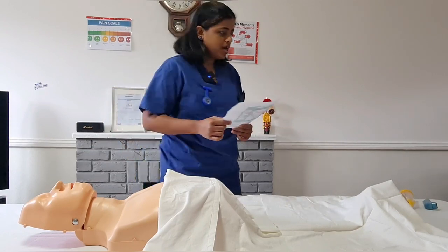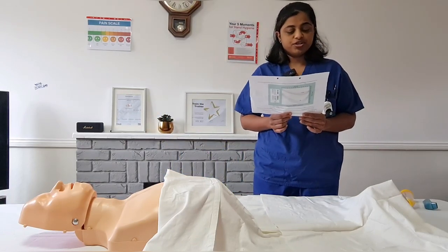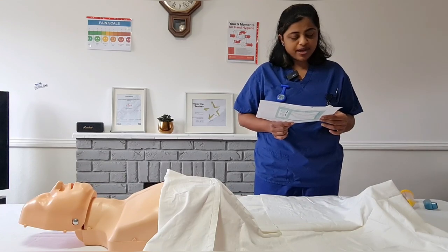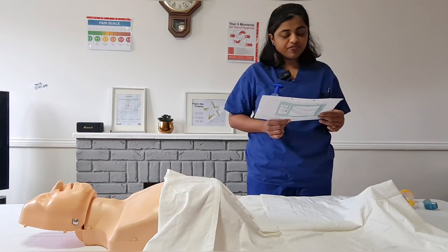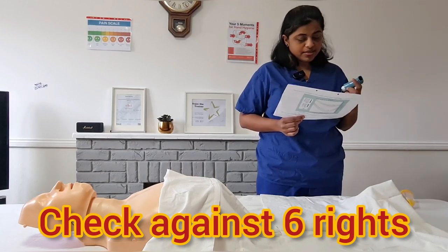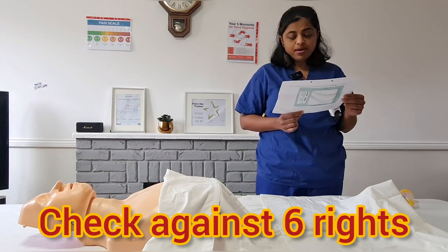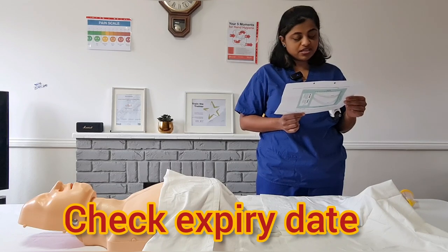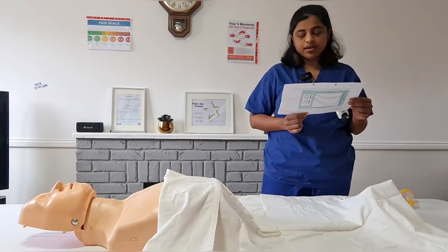Now I am going to check my medications against the six rights. I have the patient details for Miss Emma Hargraves, 2 Long Street, Northampton, date of birth 26/9/1963, hospital number 12345. The drug name is Ventolin — Salbutamol — inhaler, 200 micrograms, 2 puffs, prescribed BD (twice a day). I can clearly see the doctor's signature and confirm that Emma has no known allergies.